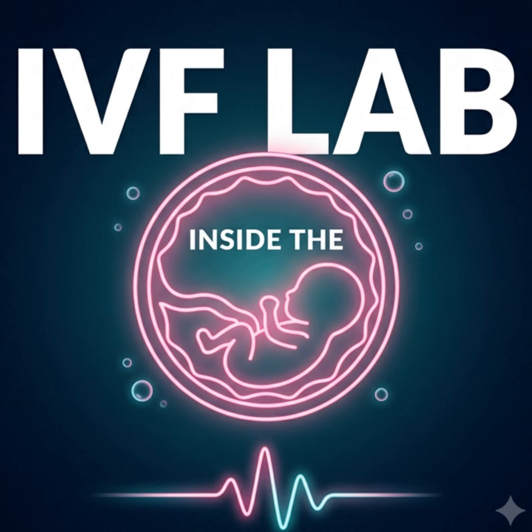And the third pillar: complex pattern recognition across massive data sets. An AI model can review the complete morphokinetic timelines of millions of embryos, cross-reference that footage with the ultimate clinical outcome, whether or not those specific embryos resulted in a live birth, and identify incredibly subtle visual or temporal patterns that correlate with success. It is finding correlations that human scientists haven't even thought to look for yet. The promise here is massive.